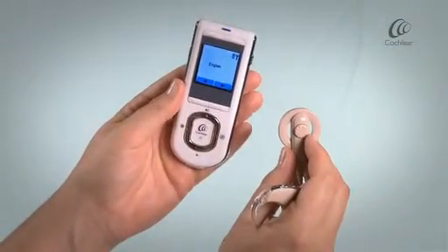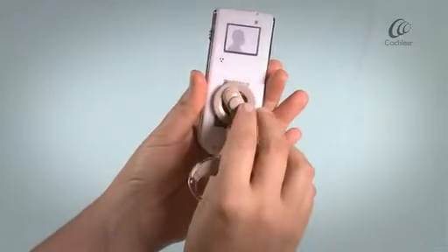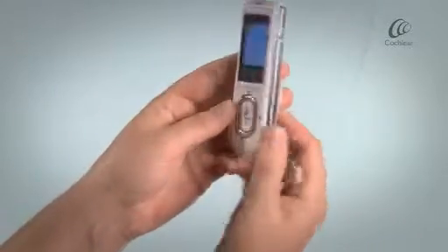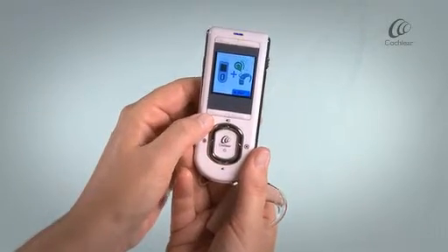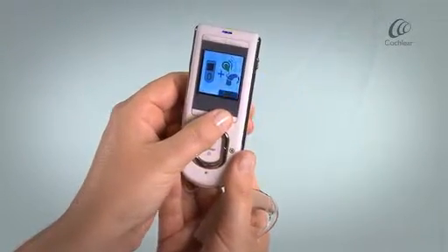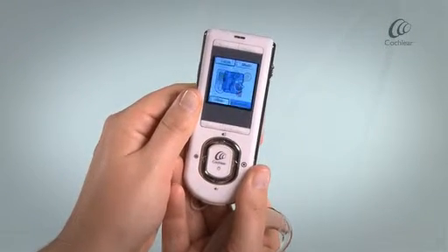Place your coil on the back of the remote assistant within the coil sensor guides. The coil check and pair screen will display. Press the lower right soft key to pair your remote assistant. A confirmation screen will indicate the devices have been paired.